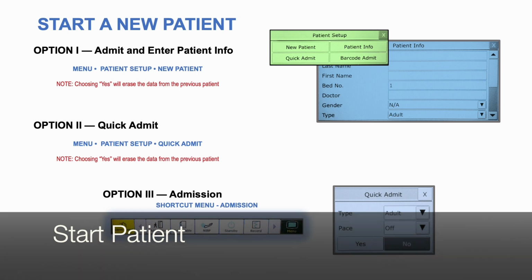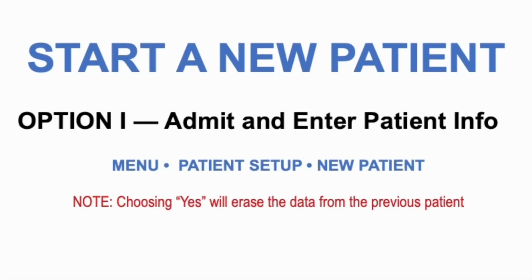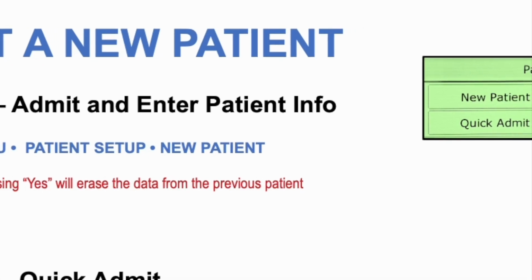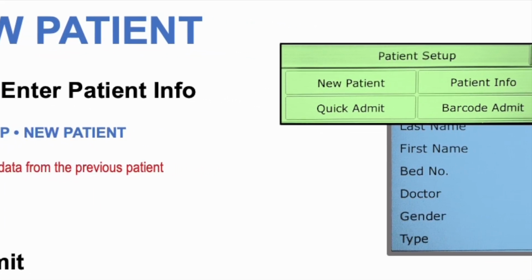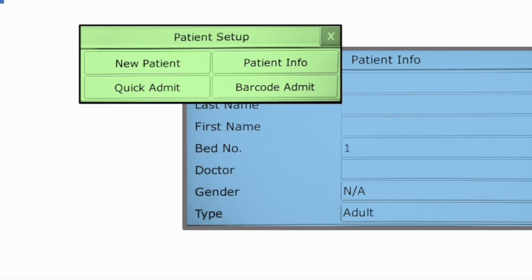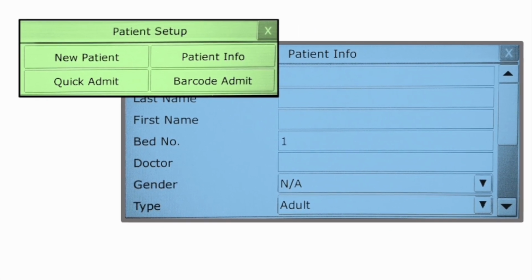Start a new patient. There are 3 options for starting a new patient: Admit and enter patient info, Quick Admit, and Admission. The first option is to admit and enter patient info. Press or touch Menu, touch Patient Setup, touch New Patient. A prompt will appear indicating the data will be erased from the previous patient if Yes is selected. The amount of information entered is optional. It will appear on the printout and the patient will be identified at the top of the monitor.